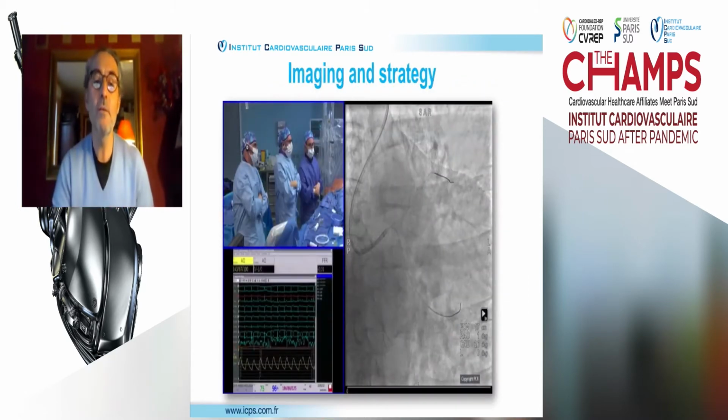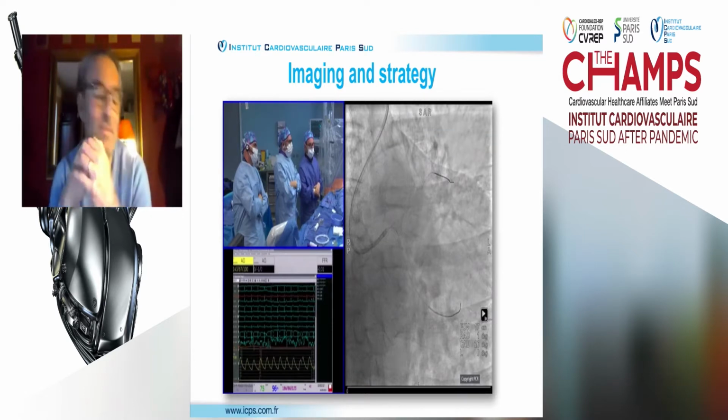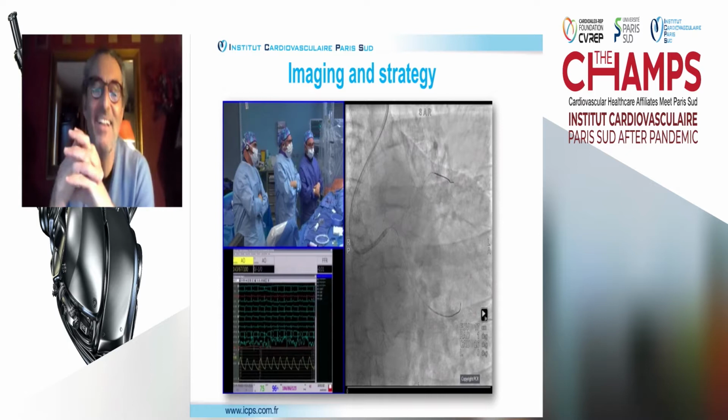Okay, let's stop here, Hakim. We'll take the opinion of the panelists first on how to tackle the strategy. Okay, let's start with Dr. Said Farag. How are you going to manage, and is this a trifurcating or bifurcating lesion? What's your opinion? Are you going to do 2 stents for the diagonal?